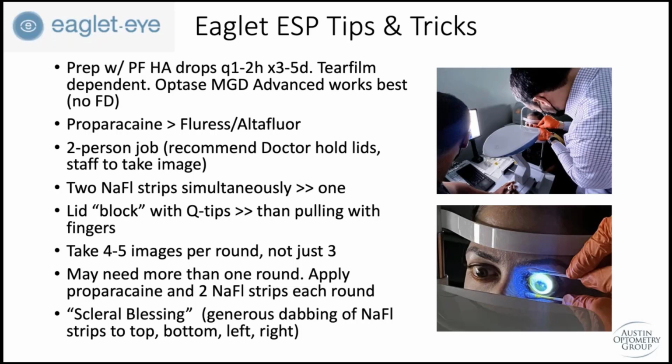Do take several pictures and then essentially assess the best ones later. Essentially, take a picture, blink and blink, open the lid, take a picture, and just do that several times, and then assess. And if you have to do it again, you can do it again.